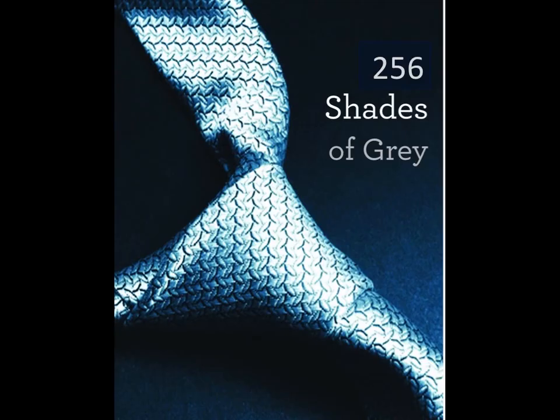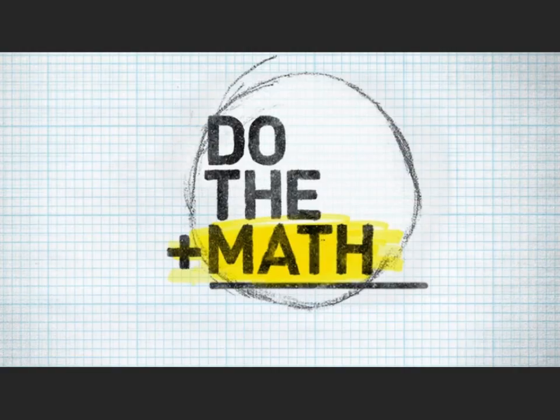So what's the problem here? Well, the conventional computer display is going to show 256 different shades of grey for a CT image, but our eye can only detect about a 6% change in grayscale. So let's do the math. I just said we can detect about a 6% difference in grey shade level. So 6% is 17 shades of grey.